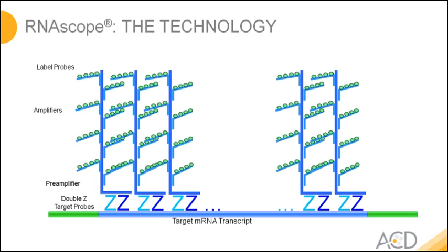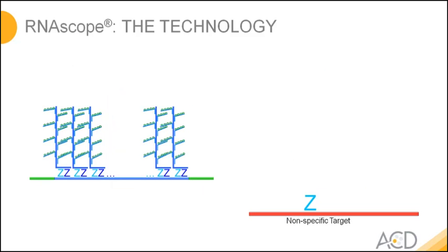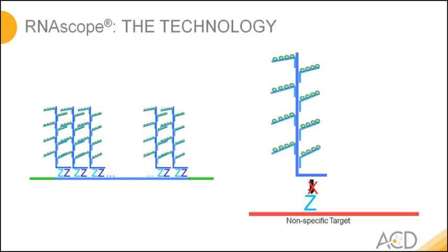A further part of the trick we use is that you can never avoid that these Z oligos shown here bind unspecifically somewhere else. This will inevitably happen. However, a single one of these Zs is not able to hold the Christmas tree. These just 14 bases are not good enough and do not have enough energy to keep it. This will be washed off. This is why the background signal stays low.